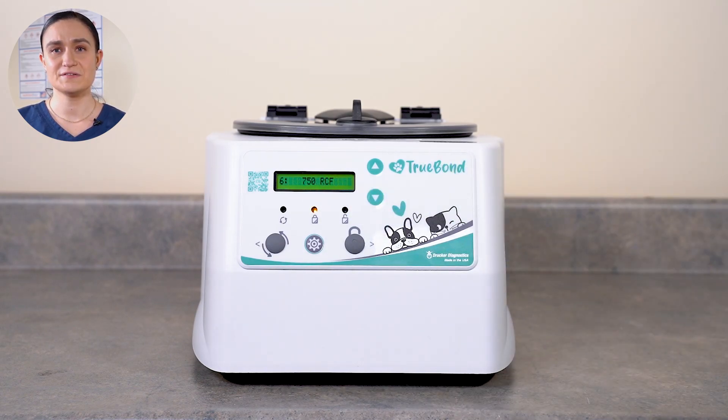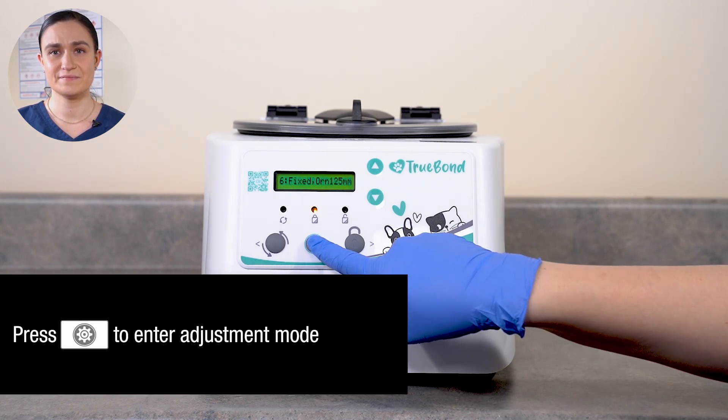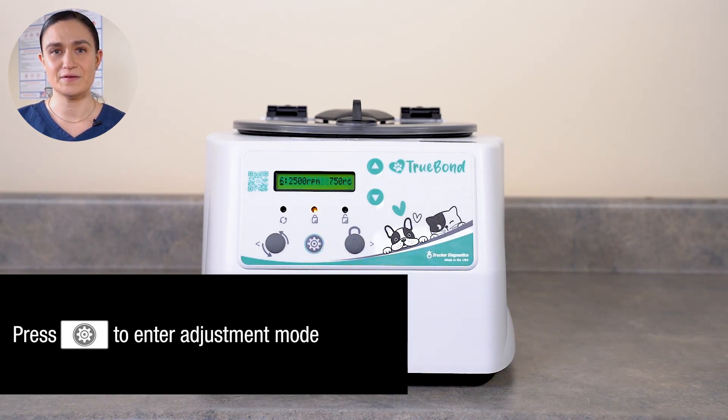With the cycle you want to use for your new settings selected, press the Menu button. This button enters Edit Mode, which will allow us to adjust our speed, time, braking, tube holder selection, and cycle name.